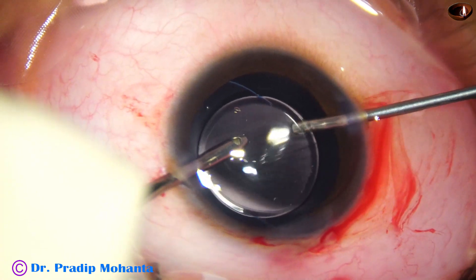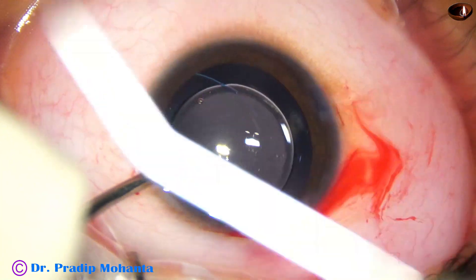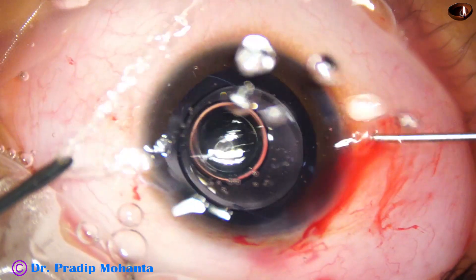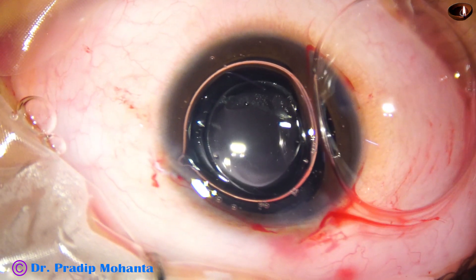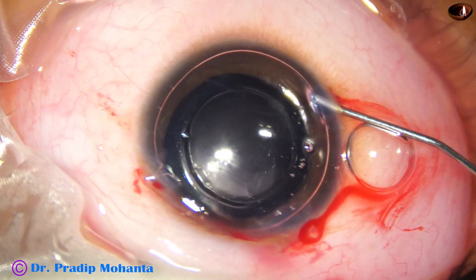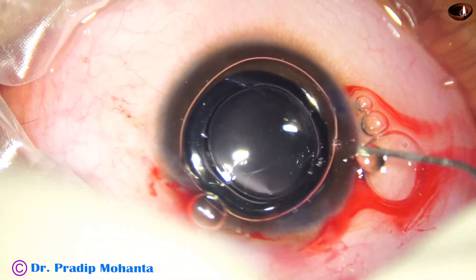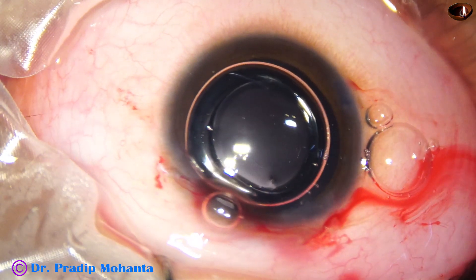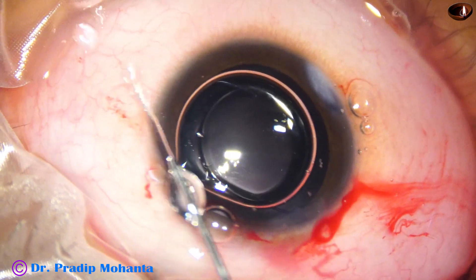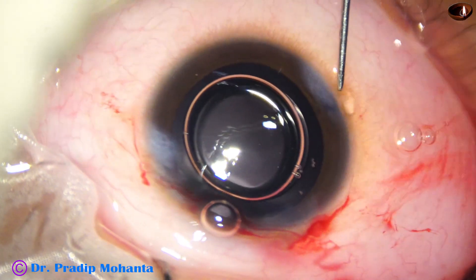A little bit of anterior vitrectomy is done. Before removing the irrigating cannula, I inject an air bubble, but the air bubble doesn't want to stay, so I inject again and again until a significant amount of air bubble is present. Now I close the side ports by corneal stromal hydration. The size of these side ports is about 1.2 millimeters.